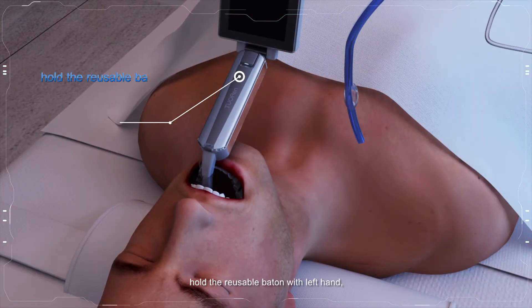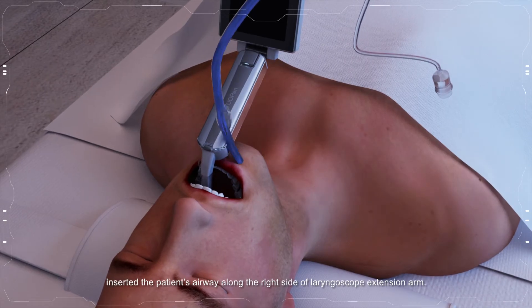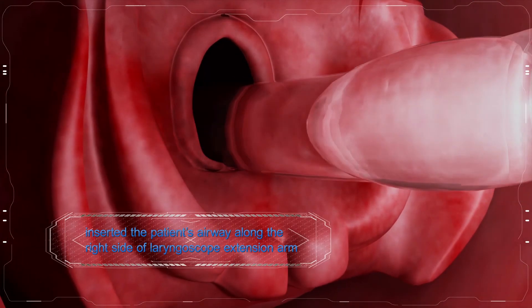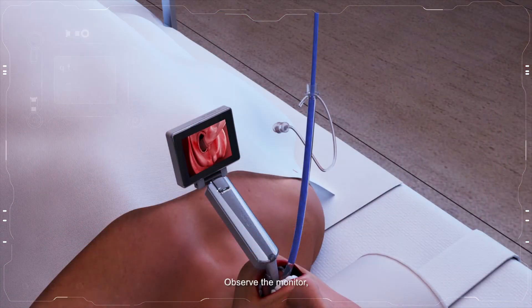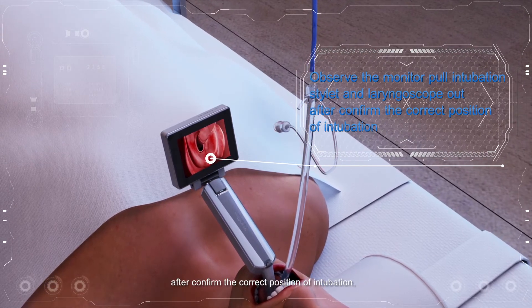Hold the reusable baton with the left hand and a formed endotracheal tube with the right hand. Insert the endotracheal tube into the patient's airway along the right side of the laryngoscope extension arm. Observe the monitor, then pull the intubation stylet and laryngoscope out after confirming the correct position of intubation.